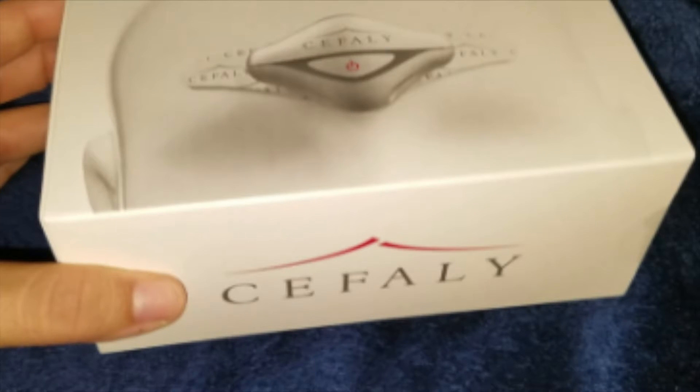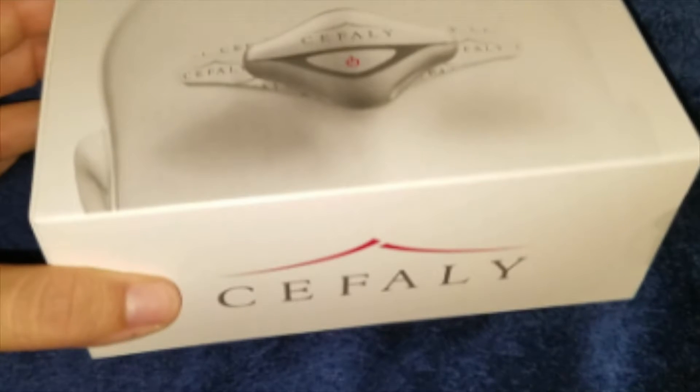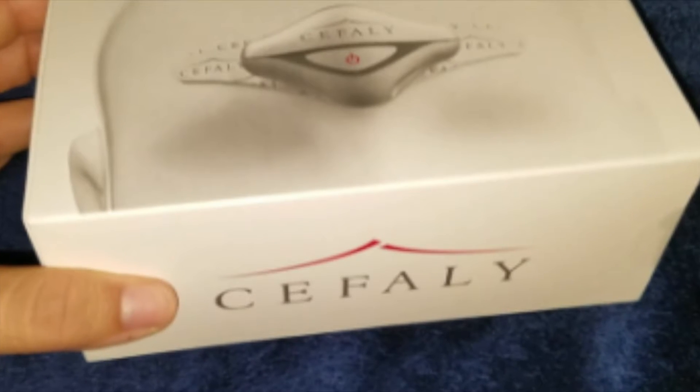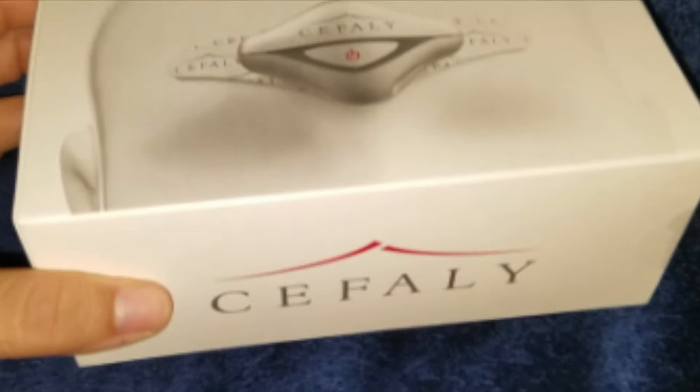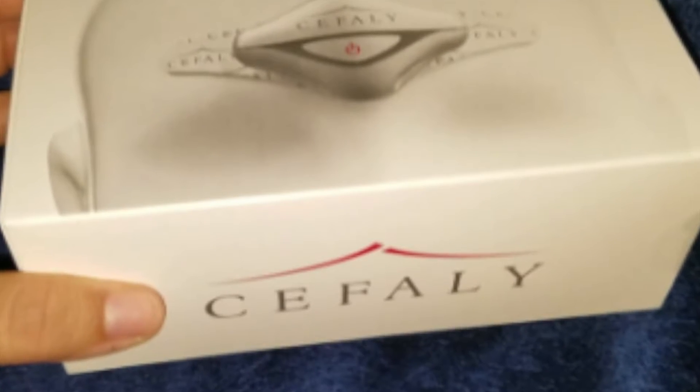Hey everybody, this is going to be a video of unboxing and my first use of this Cefaly device. This device is supposed to help prevent migraines, which I suffer from, probably for the last decade now. So I decided to try this.